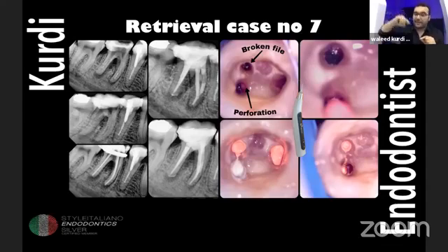So in this case, if you look at the top right image, I put a gutta-percha cone in the other canal, and when I started my activation near the file, it did not go deep. It just went deep to strike the gutta-percha and then outside the canal. So my tip for you, if you are going to deal with this type of canal anatomy, please put a gutta-percha cone in the other canal before you use the ultrasonic activation inside or near the file.